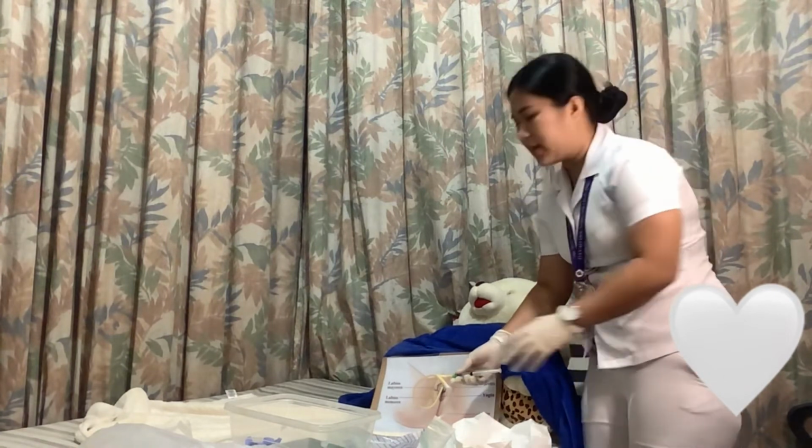Secure the indwelling catheter by taping it to the patient's thigh. Allow some slack of the tubing to accommodate the patient's movement. So this helps the catheter to stay secure properly.